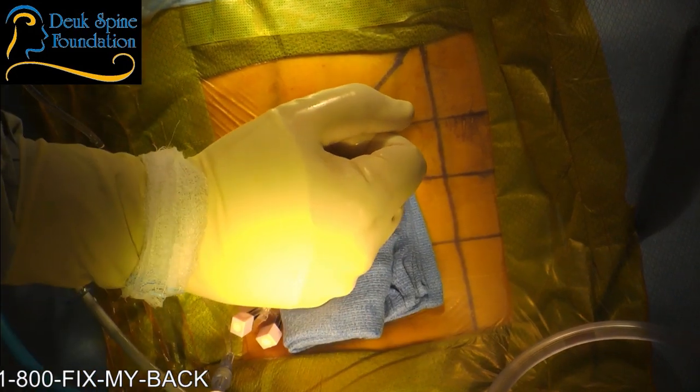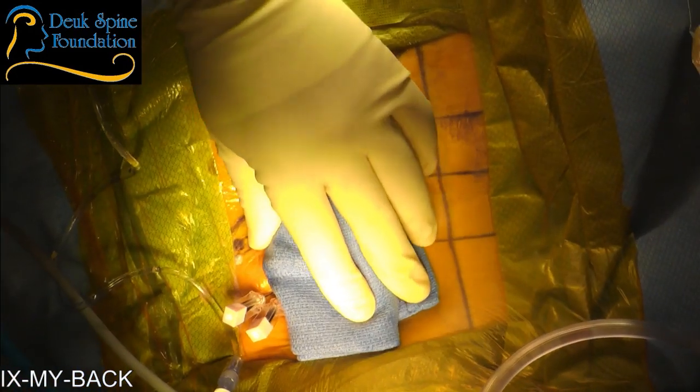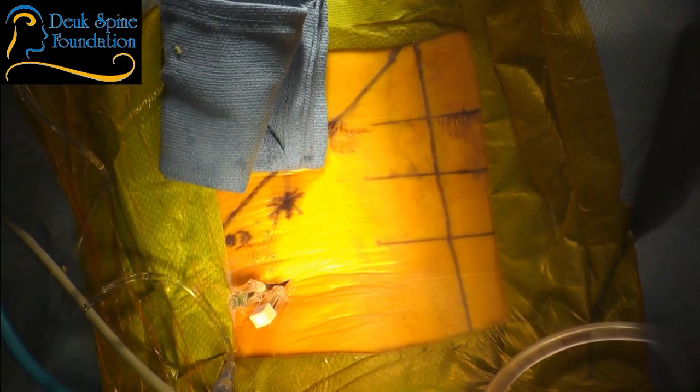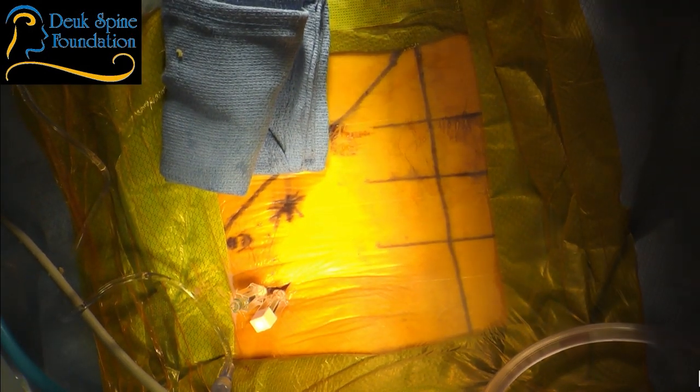We're going to get started on the second one, and I think I'm going to do the L4-5 next. So let's go ahead and get the guide wire in.